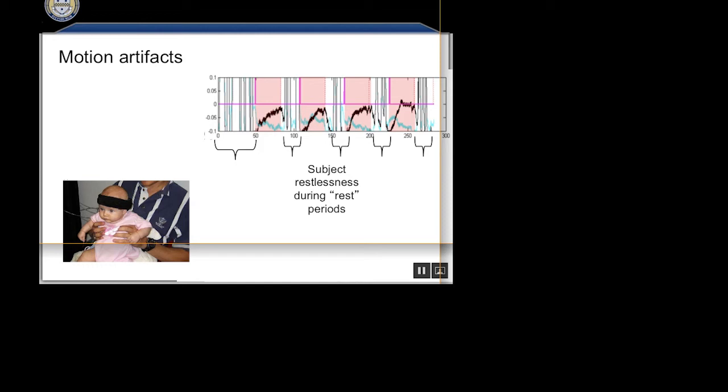And so if we take those ideas of the statistics, and I want to estimate the average amplitude here and compare it to the average amplitude here, well, the averages are different. The problem is the error bars on this part, the baseline period, are so large that I fail pretty much every statistical test I can do, right? And so that becomes a problem with this. And we talked about it a bit yesterday.